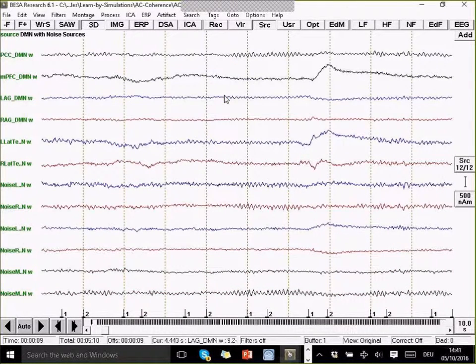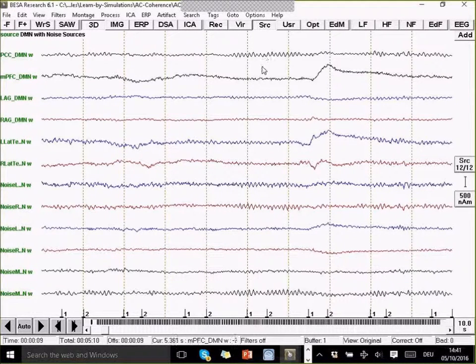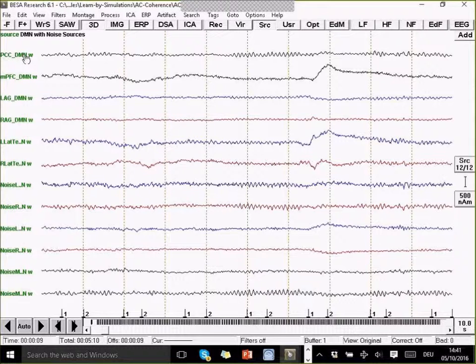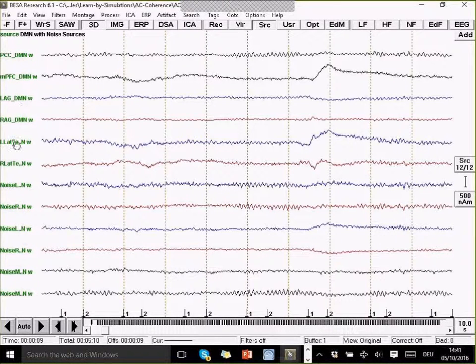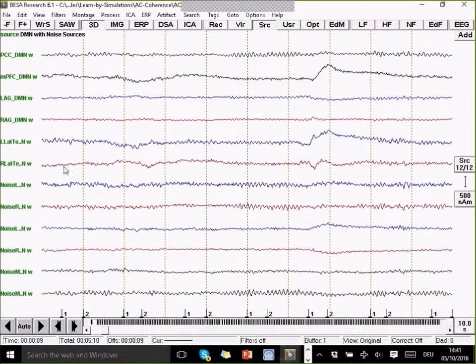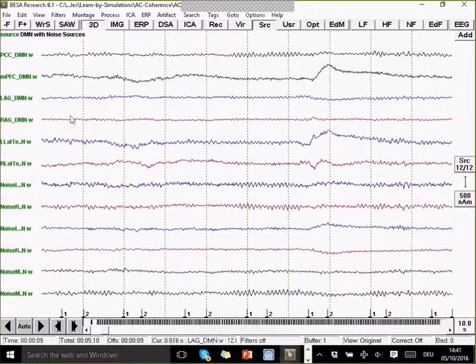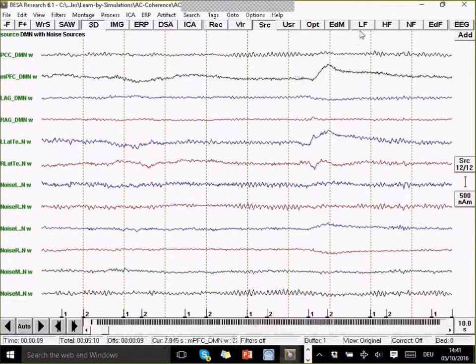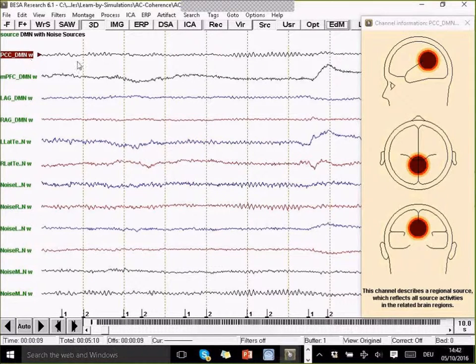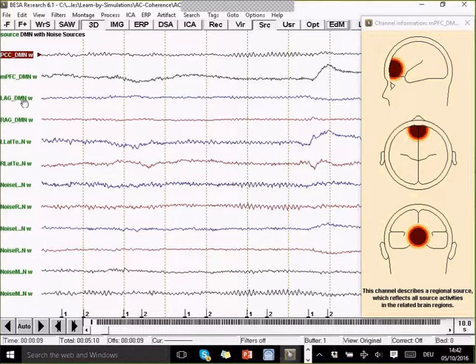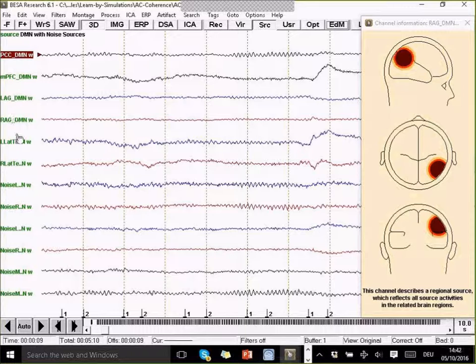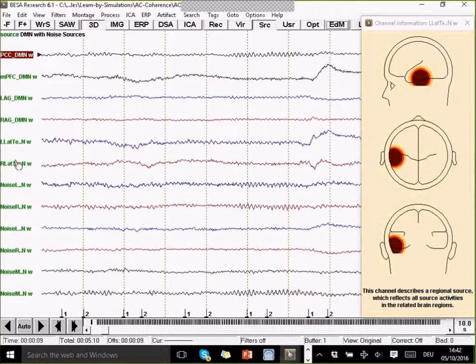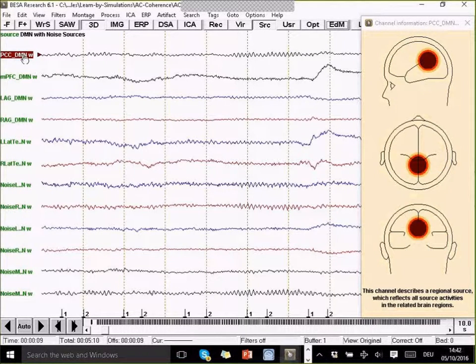If I go to the DMN, then this data is now transformed into default mode network sources. These are regional sources. We have two, three, four, five, six sources accounting for the different aspects of the default mode network plus another six sources that should account for noise, so for unrelated brain activity. The sources are, you can see there are rough representation where they are by right-clicking on their labels. So they are in the different aspects that are relevant to the DMN.